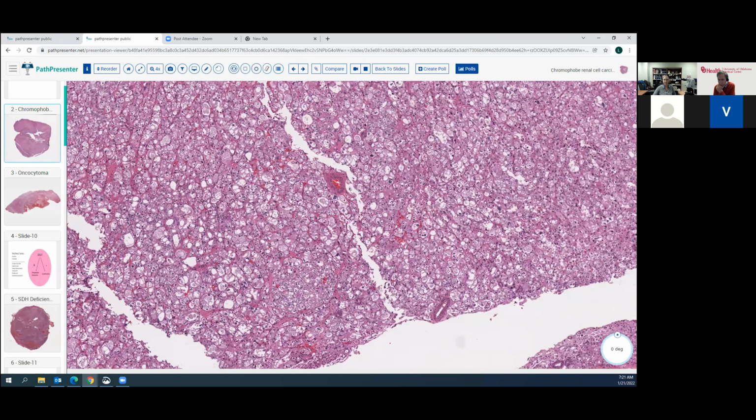So let's see. I have to pull this from the slide deck. Okay, so here's our next interesting case.